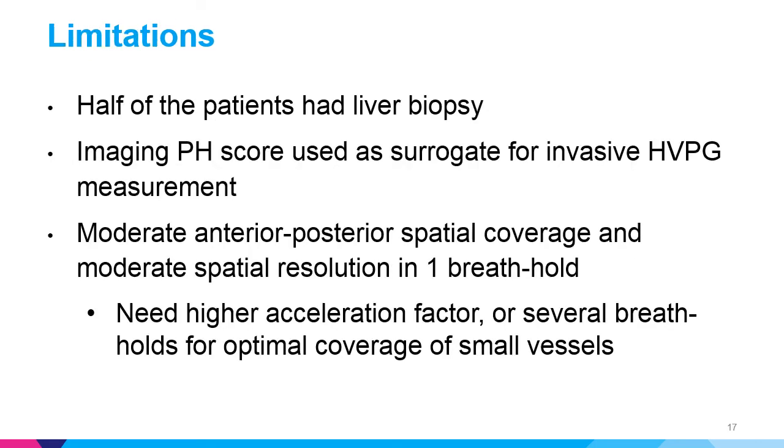Our study had some limitations. Firstly, half of the patients had liver biopsy, and where biopsy was absent, we used imaging findings to infer the presence of cirrhosis. The imaging PH score was also used as a surrogate for invasive HVPG measurements.